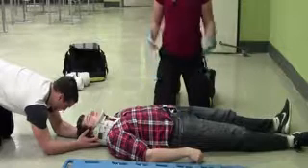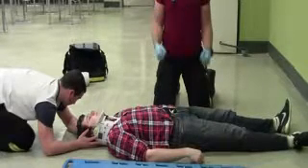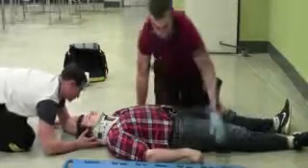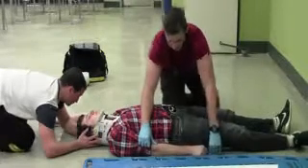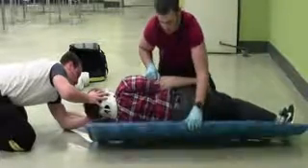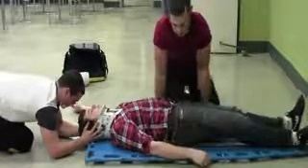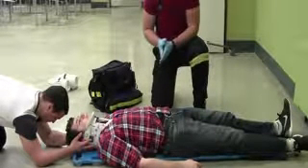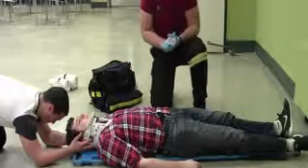Next, we're going to put the patient onto the backboard. On Steve's count, we're going to log-roll the patient towards me, and then log-roll him back down onto the backboard. Remember to start strapping from the chest, hips, legs, back up to the head, and then the figure eight on the feet last.